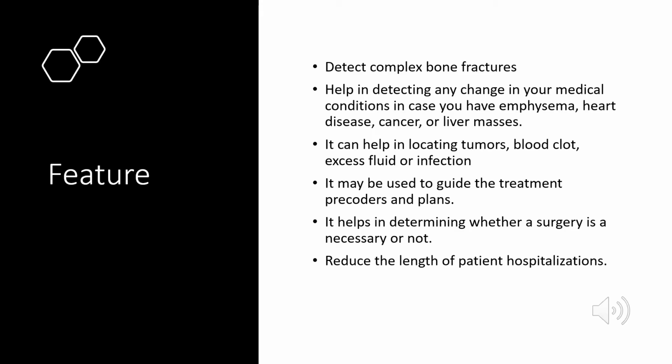Features of CT scan. CT scan images are more detailed than conventional X-ray images. They can reveal bone, soft tissue, and organs. Conventional X-ray uses fixed tubes that send an X-ray in one direction. However, one of the most important features of a CT scan is that it uses a motorized X-ray source that shoots a narrow beam of X-ray as it rotates around the patient.